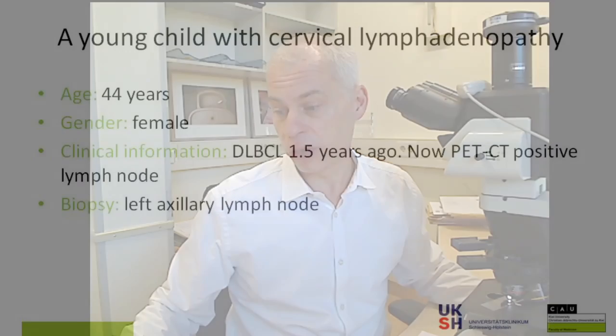My name is Wolfram Klapper from the Department of Pathology, Hematopathology section in Kiel, Germany. And I want to address a very common topic with this case. The topic is a little bit about what I should do if I don't see anything relevant in my H&E slide. So this is the first case. This is the case I want to present today.